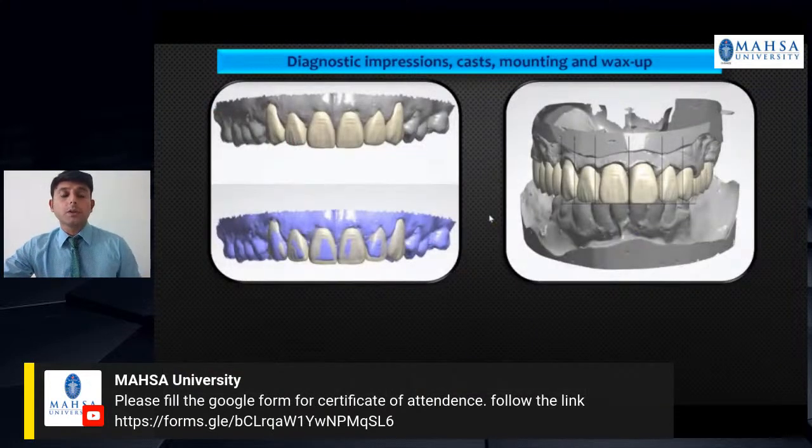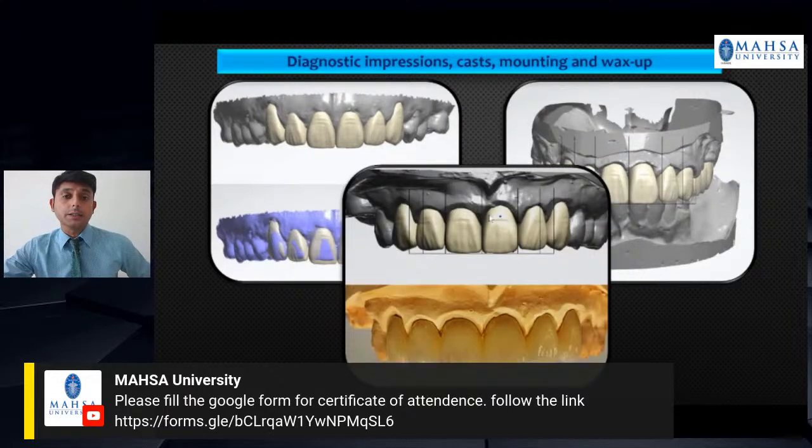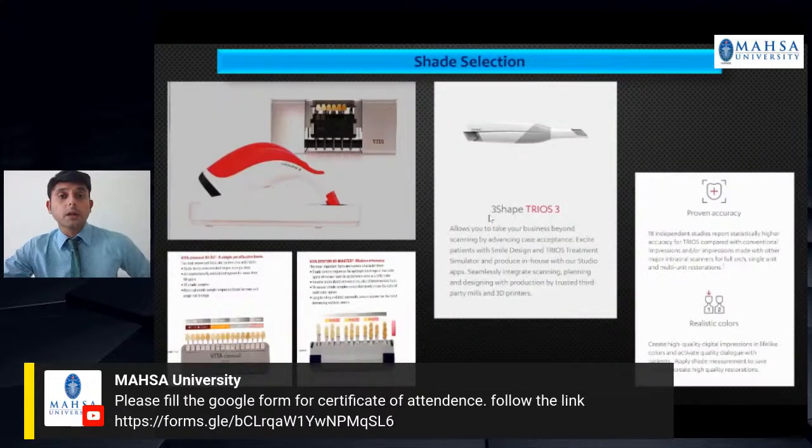This is a visualization of how the wax ups in the softwares look like, and the final visualization can be done using the smile designing softwares.